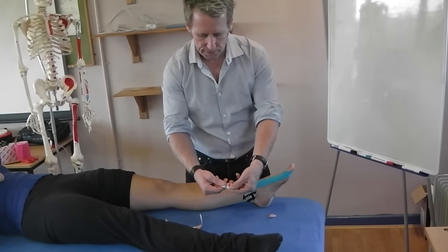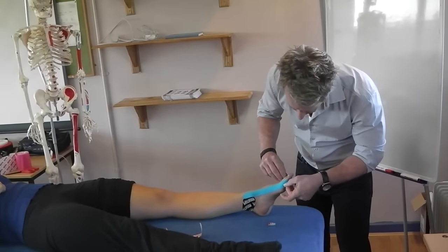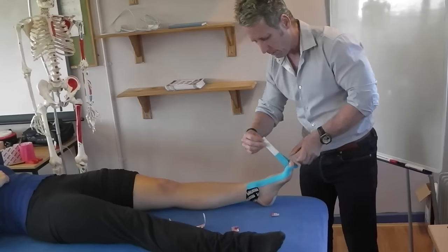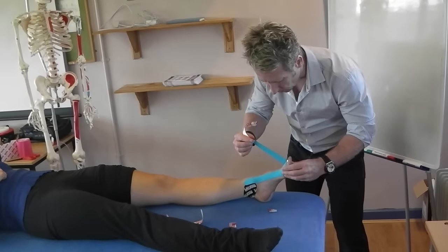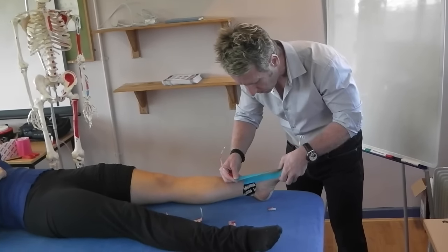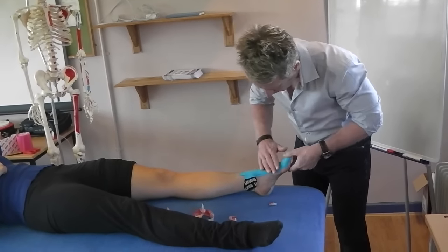For the second one, again I'm going to split the tape and peel that back and apply this around this side, so it just contacts the second piece of tape, and then pull that on. Then with the foot in that abducted position, I'm going to tension at 50 to 75%. From there I'm going to mould this tape down so that it follows the first piece.